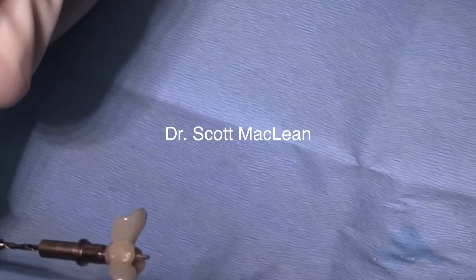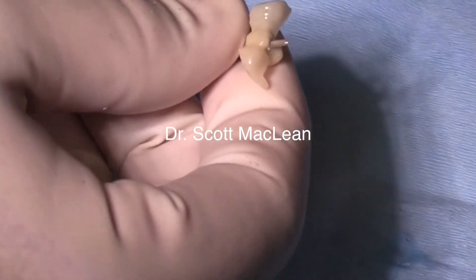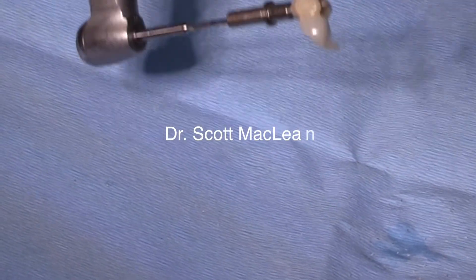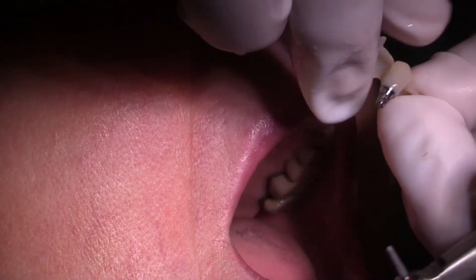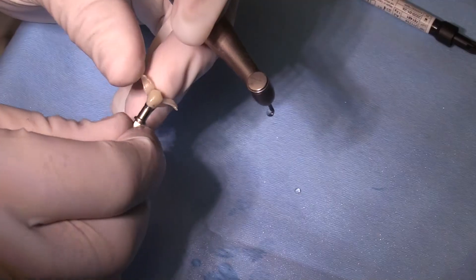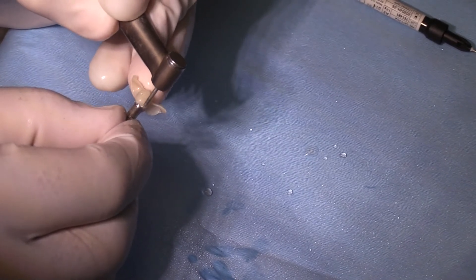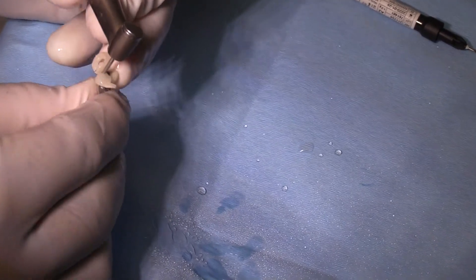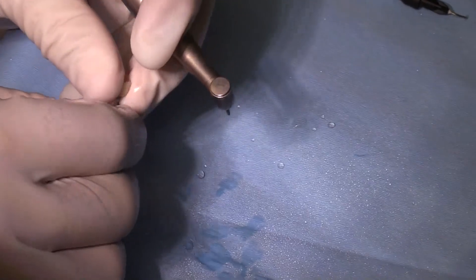It's held by friction in the analog, so we'll open it up a little with an 88KR diamond and then put a screw in. If the screw channel comes out at the incisal, you can add a little flowable after the screw is placed and build it back. Now the temshell can be adapted and the wings cut off. We'll adjust any imperfections around the base of the abutment interface — it doesn't have to be super smooth. The lab made this temshell polished and perfect.